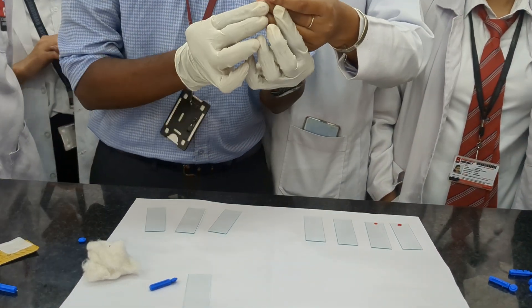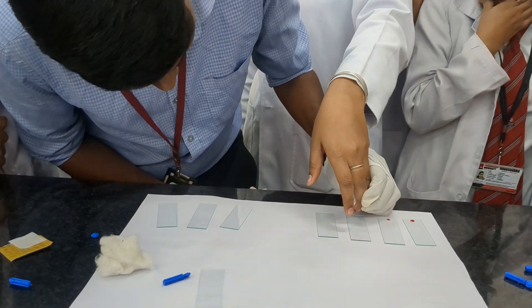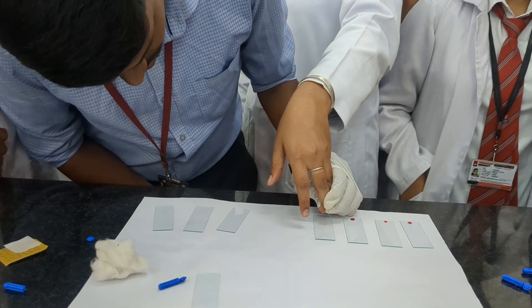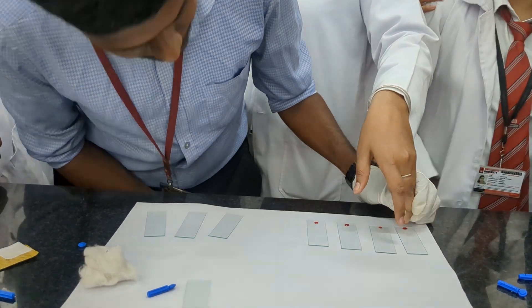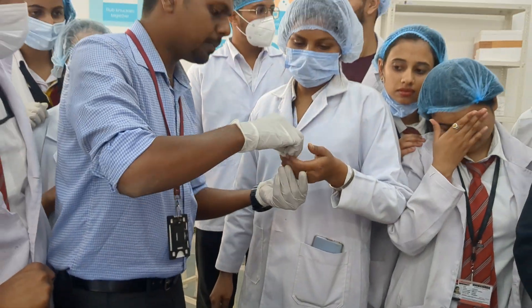Can you squeeze your finger? Is it painful? Add one drop of blood like this to each slide. Then clean the finger.